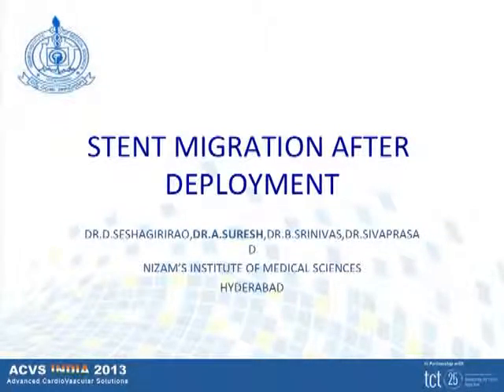Today I am going to present an interesting case of stent migration after deployment. It's a 40-year-old male patient presented to us with bilateral lower limb claudication pain since 6 months. He was having moderate claudication pain according to Fontaine class 2B, and his risk factors were that he was a smoker and alcoholic. On investigations, ECG was within normal limits, echo was normal, no RWMA of LV, good biventricular systolic function.